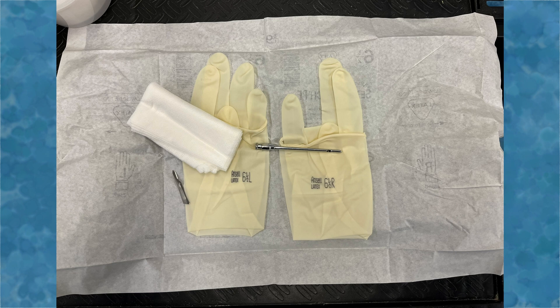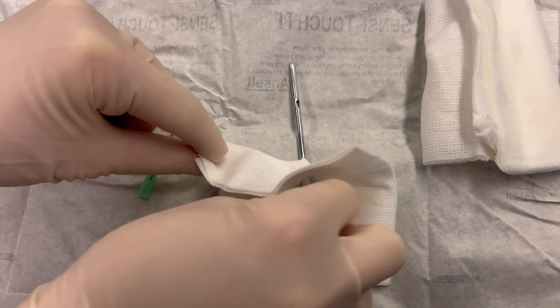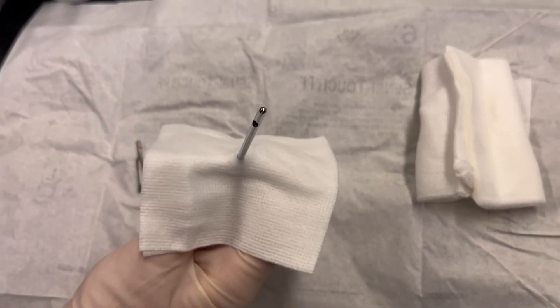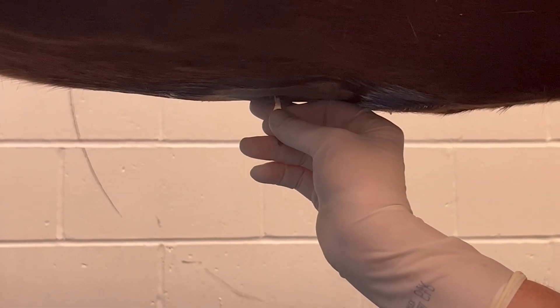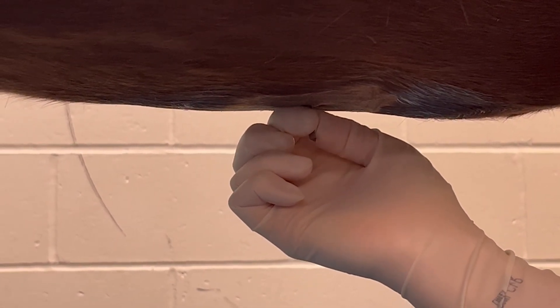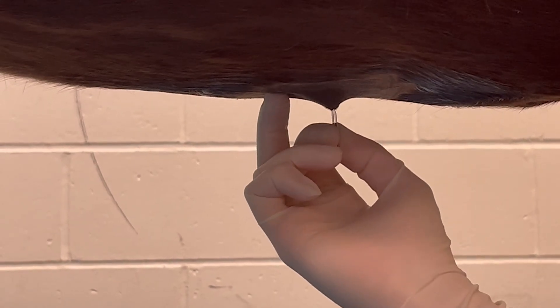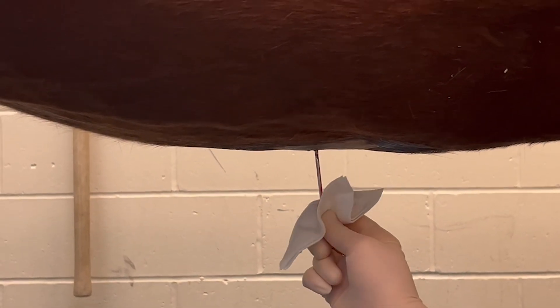Once the site is aseptically prepared and blocked, sterile gloves can be opened and materials deposited on your sterile field. The collection tube should have caps removed and can be held by an assistant or with the collector's non-dominant non-sterile hand. The T cannula can be placed through a gauze square to catch peripheral blood from small vessels on the body wall and prevent blood contamination of the sample. The blade is used to make a stab incision into the skin at the center of the lidocaine block, inserted until the end of the cutting edge to nick the external rectus sheath, then rotated 180 degrees to clear a large enough pathway for the T cannula.